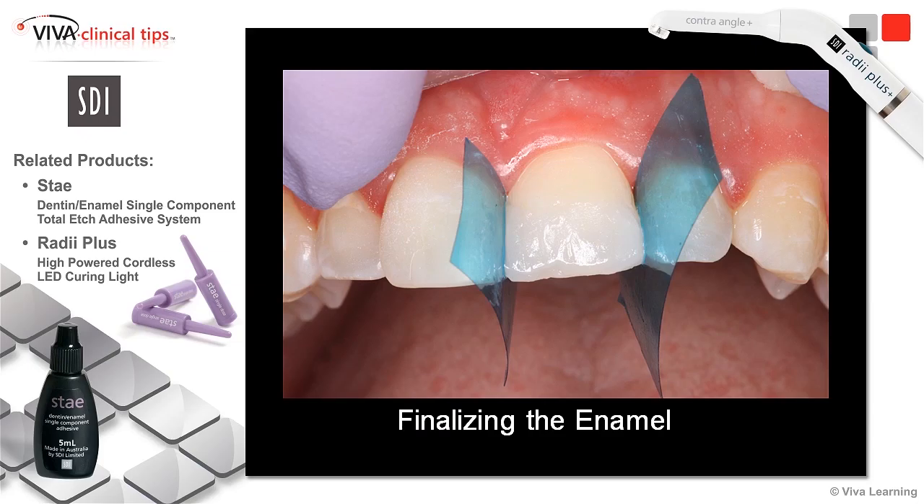Here you can see I'm finalizing with my enamel layers, and I'm respecting the rule of thirds — the dentin, dentin-enamel, and mainly enamel — so you can see exactly how I brought this out, making this look real and lifelike.